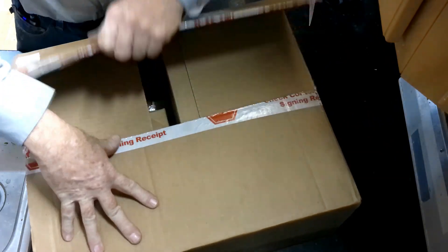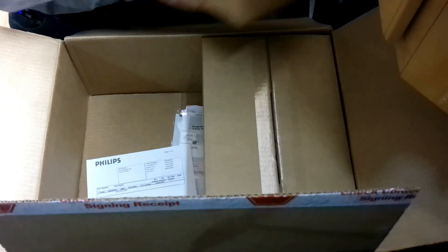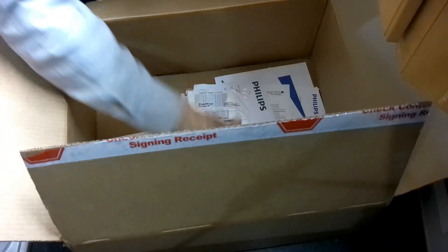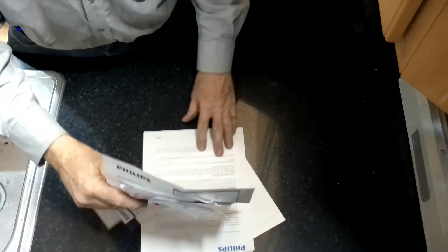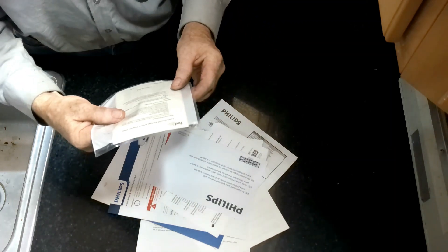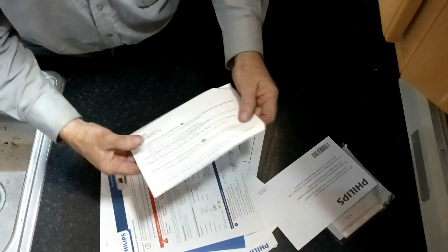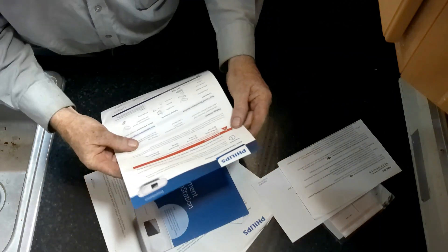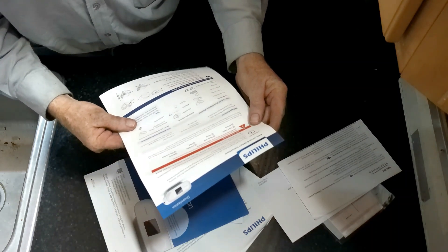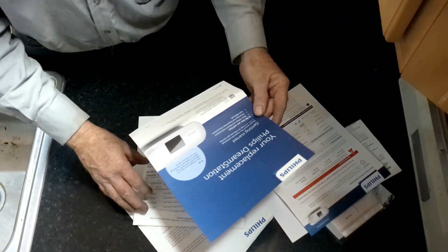So we're going to open this up and see what's inside. I've got two boxes and a bunch of papers. I'm sure one of these papers is probably the apology from Philips. We have a return package perhaps, a bunch of stuff to download, cleaning instructions, setup and return instructions — I guess they want my old CPAP — and information on my Philips DreamStation.